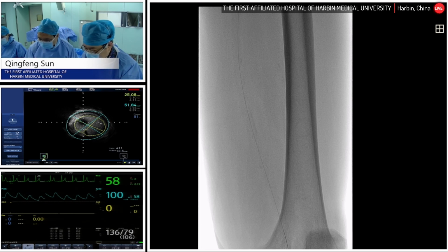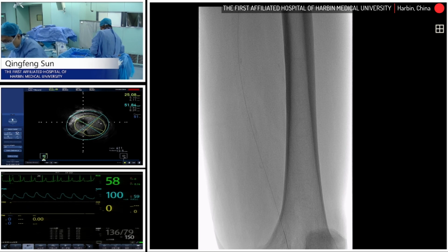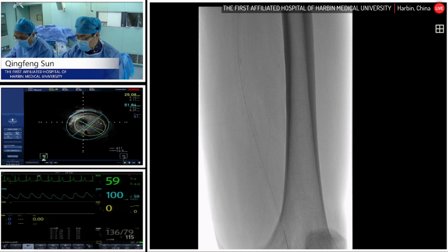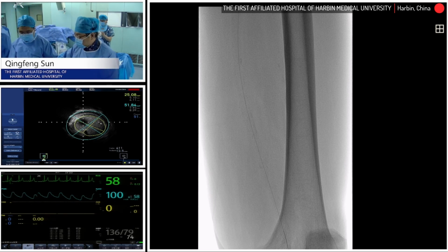Judge Zhou, we have 3 more questions. The audience wants to know what is the longest stent in our cath lab? In our hospital, the longest one, I think, is 150. From which company? EV3. Is there a 200 stent? No. Just the 150.